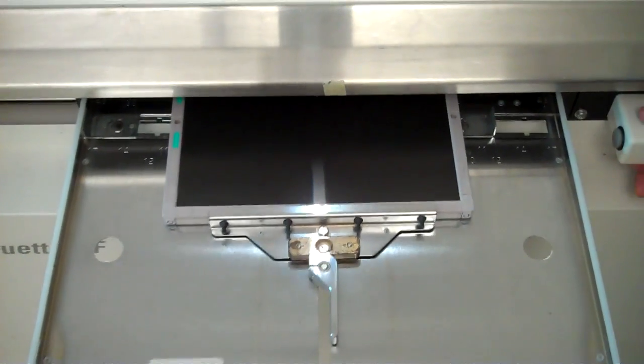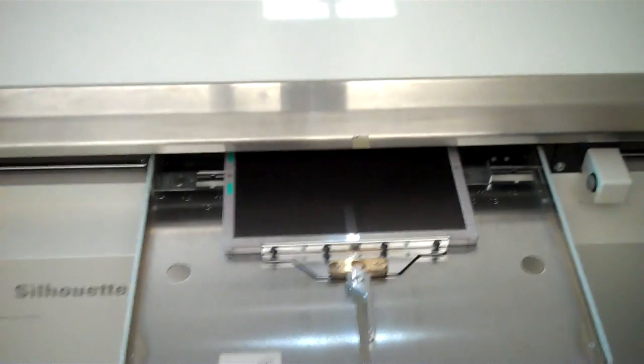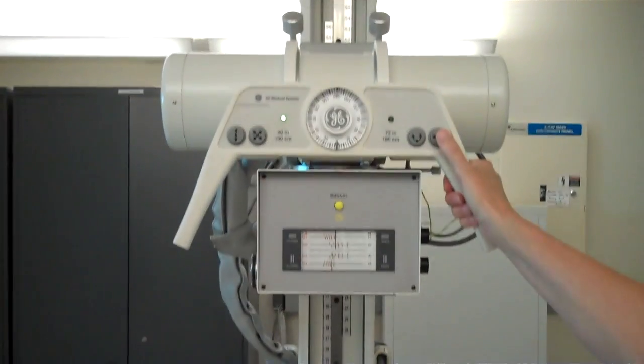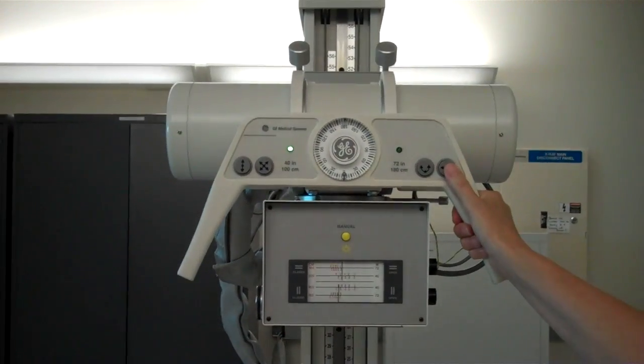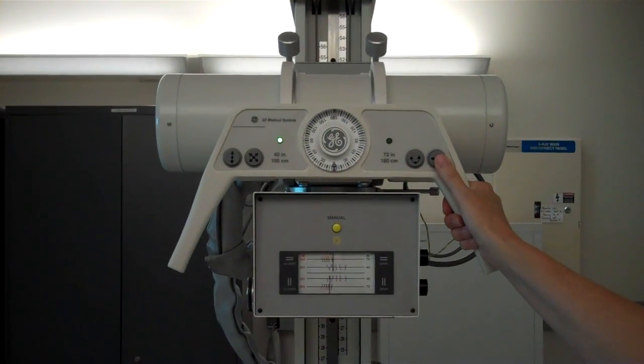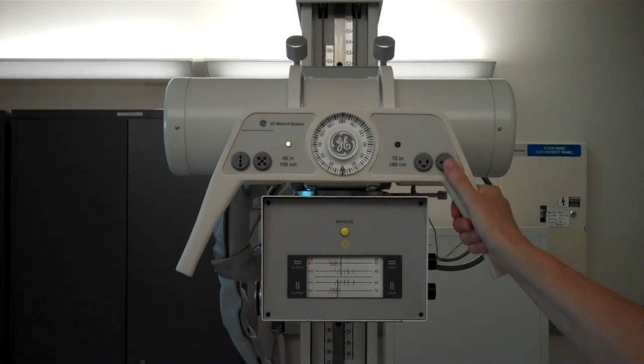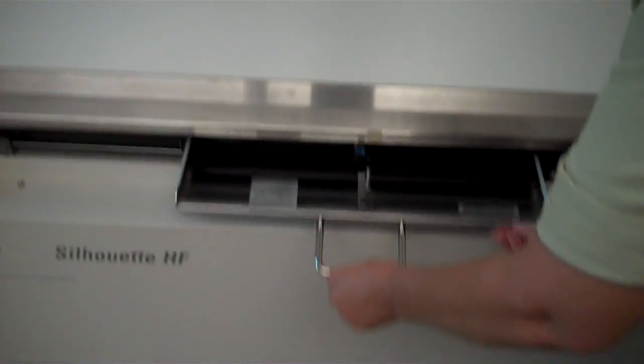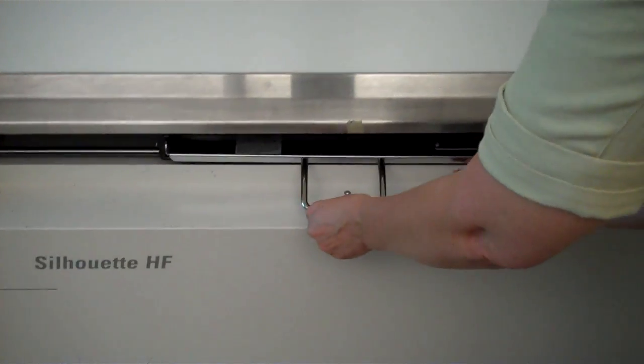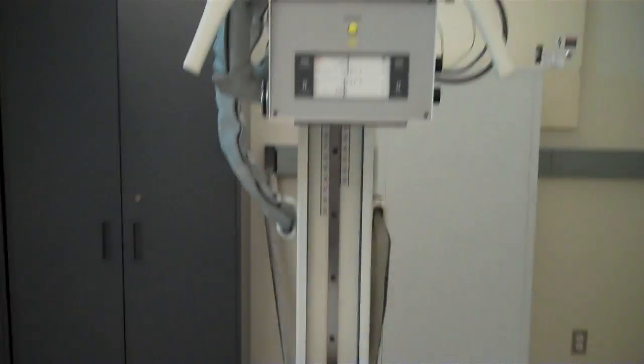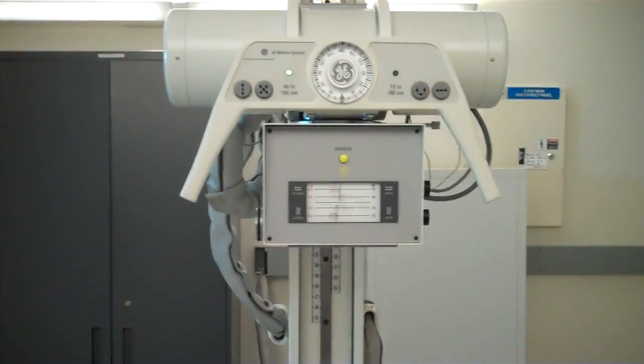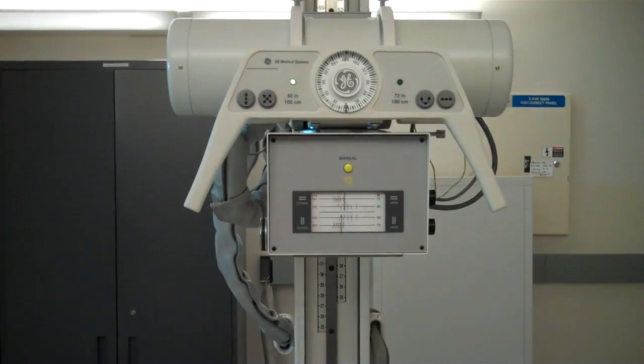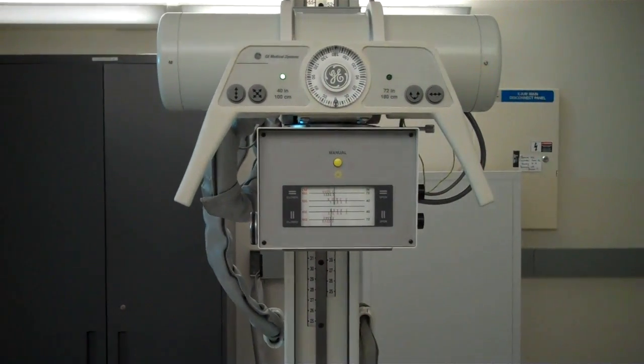Your other option is to move the tube using the longitudinal button right here so that you can get alignment. Now we push the bucky all the way in and we have tube image receptor alignment at 40 inches.